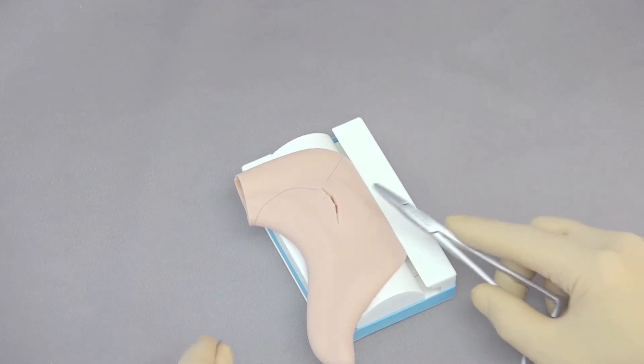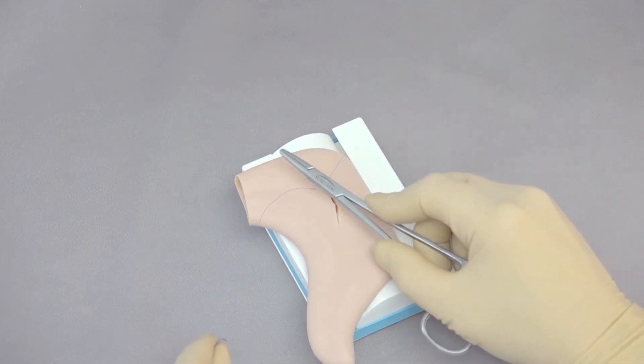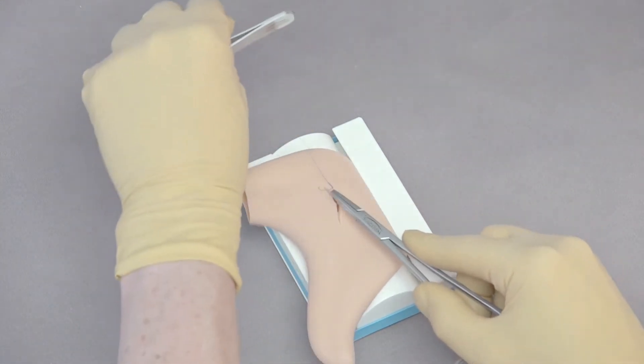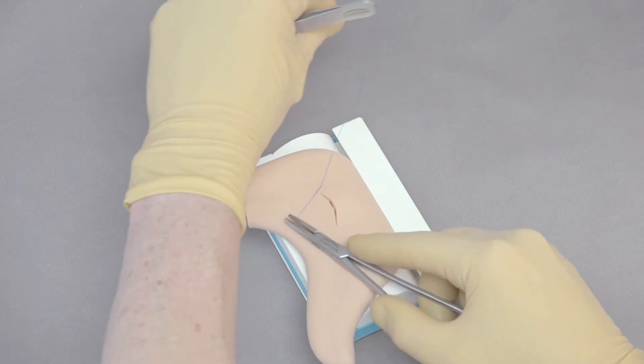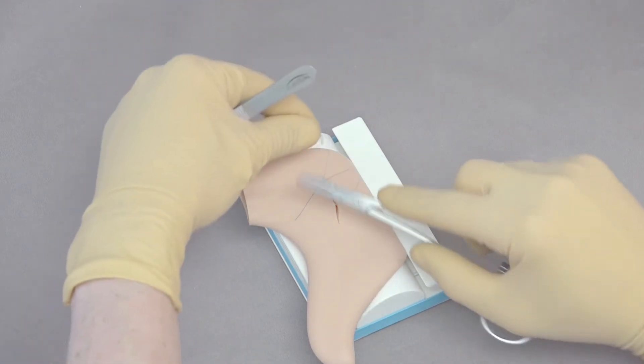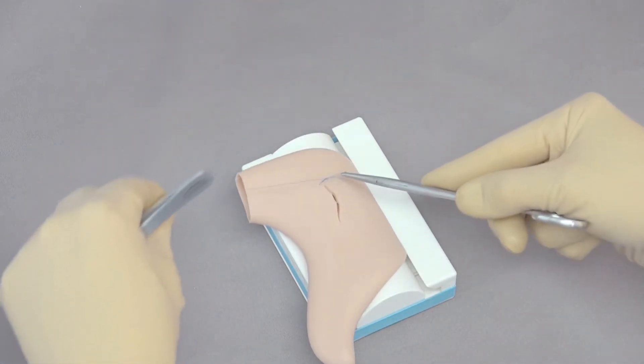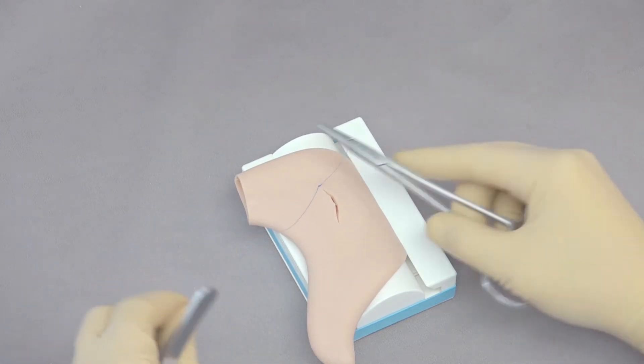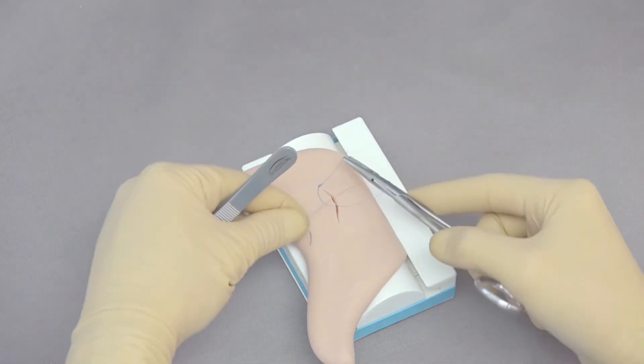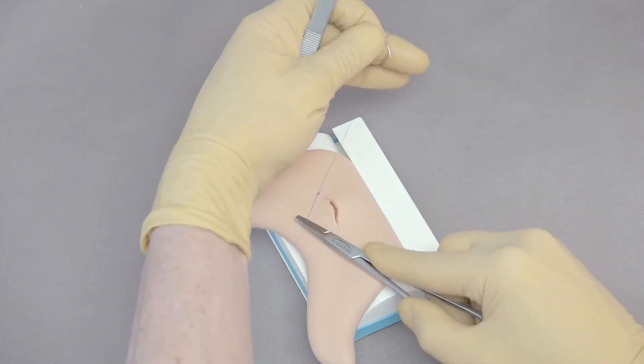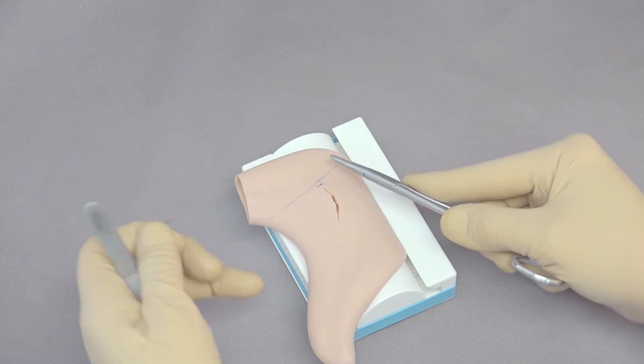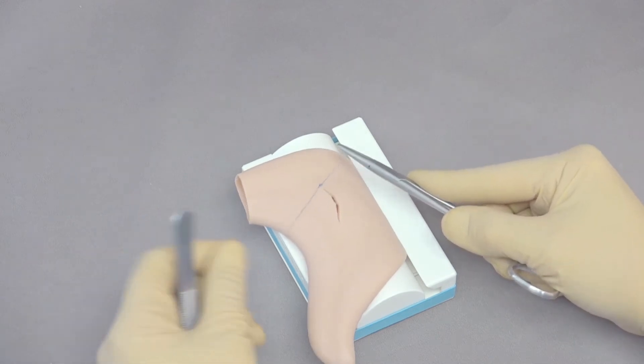To do this, we're going to use square knots. Needle holder goes in the middle of the loop, around once, and tightens. Back in the middle, around once, and tighten. We're going to snug it down until we have the tissue opposing. Back in the middle, around once, and tighten. Back in the middle, around once, and tighten. That's four throws. Most of our modern sutures work very well with that.